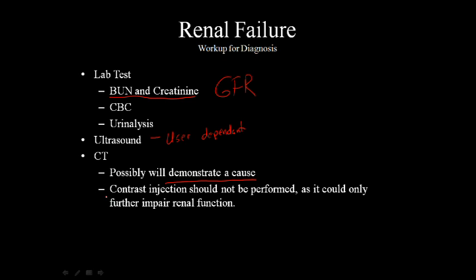However, one thing to keep in mind is that contrast injection should not be performed, because all it's going to do is impair renal function, and so potentially you're going to see GFR go down and an increase in creatinine and BUN levels. So you definitely don't want to inject contrast, because all it's going to do is make the situation worse.